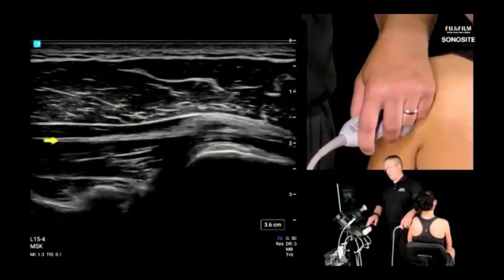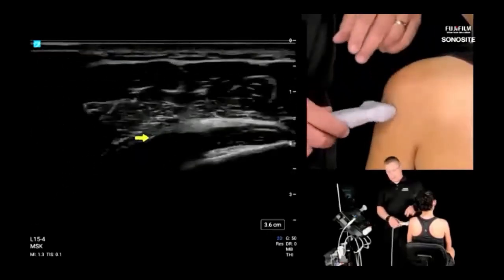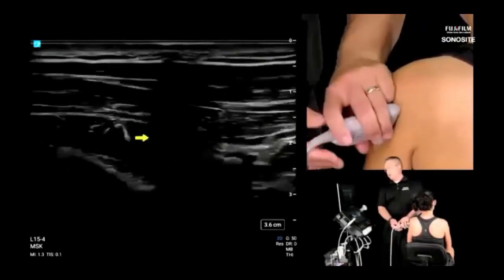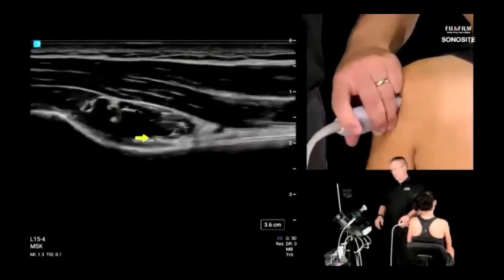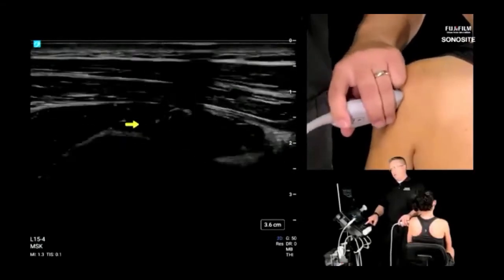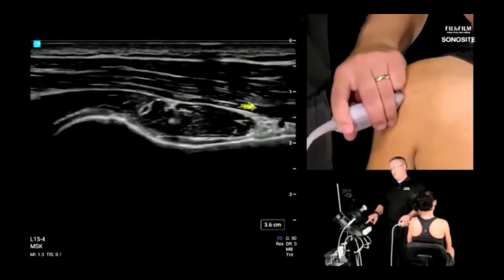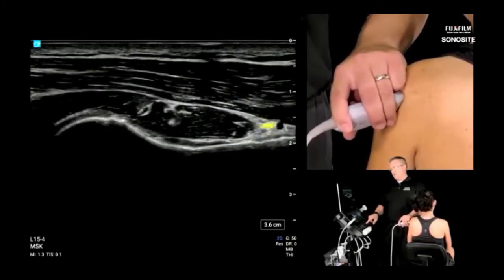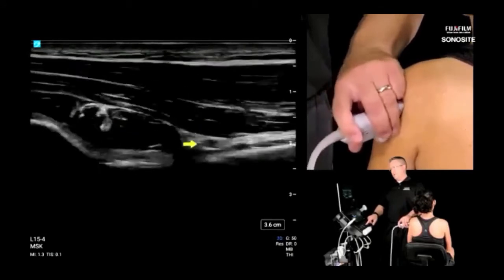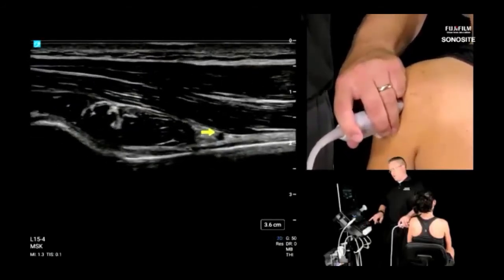Can you repeat the quadrilateral space scan? Yeah, there's a quadrilateral window here where the axillary nerve outpouches from the axilla. And you want to follow that. This is where the teres minor actually is. Really, really fun to learn how to scan. So here's our humeral head, neck, follow the neck down. And then this is the quadrilateral corner or space right here under the teres minor belly, muscle belly. So here it is where we have that circumflex humeral, that posterior branch, that artery right there.